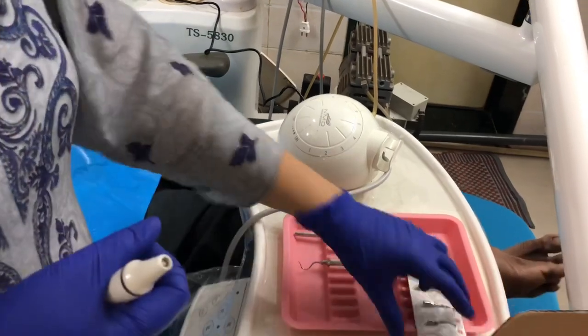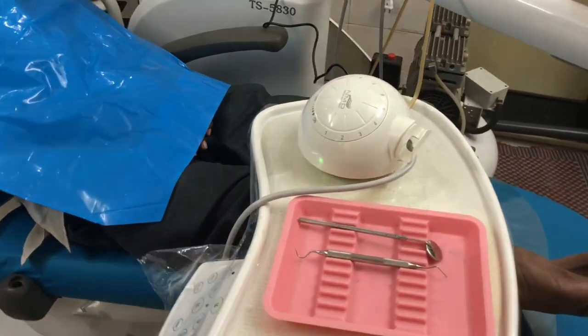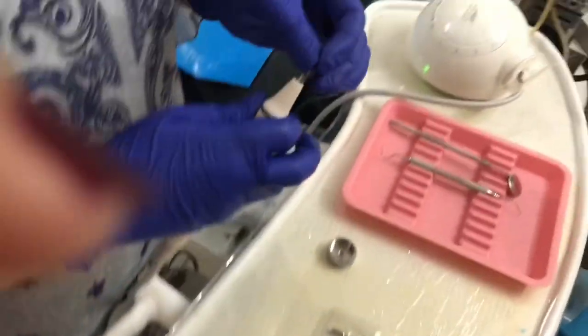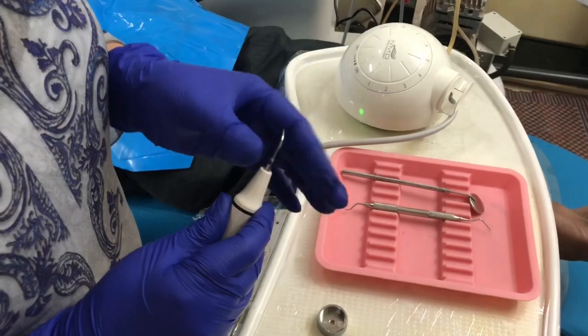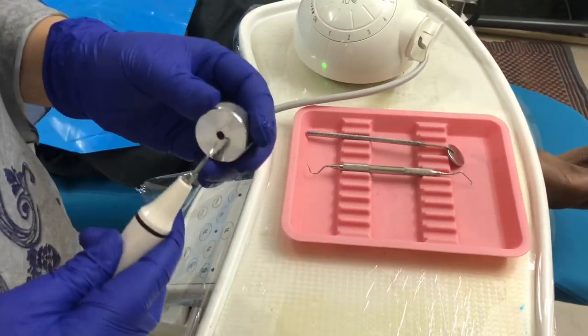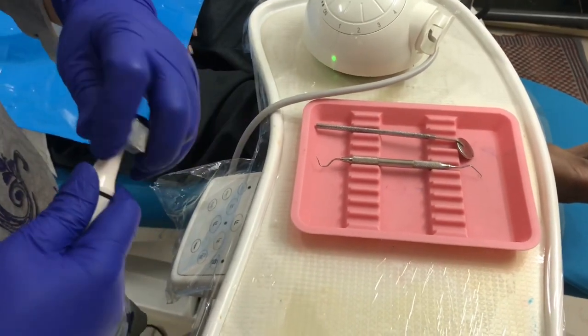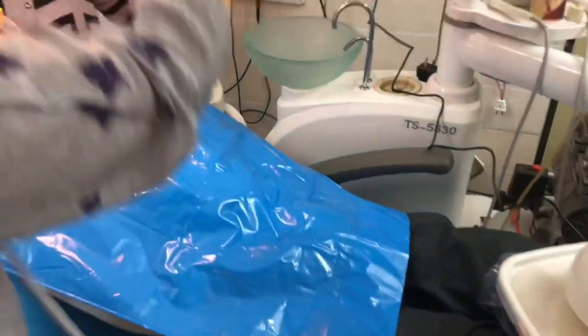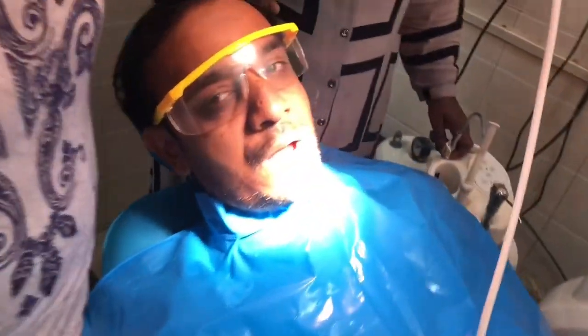So let's do it on a patient now. You can see it with the foot rest.